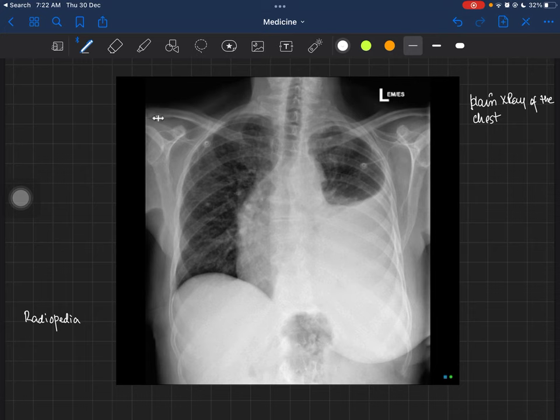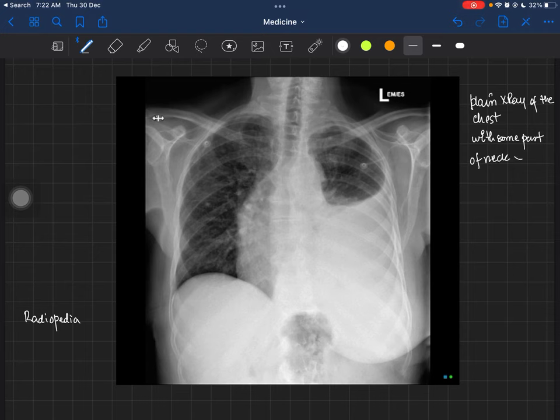As a medical student you also need to identify the anatomy. This is a plain X-ray of the chest — we are primarily trying to visualize the lungs, chest, and mediastinum, but some part of the lower neck and abdomen is also visible in this X-ray.